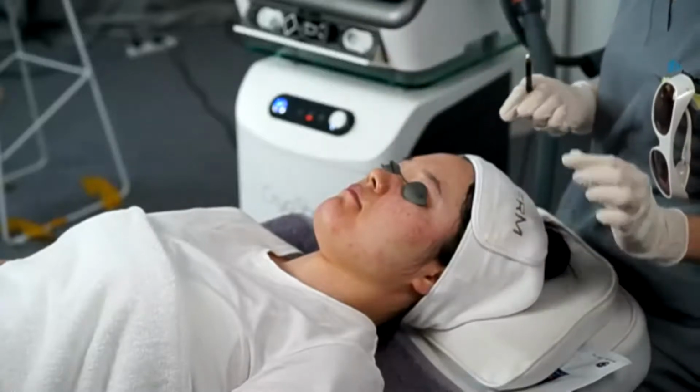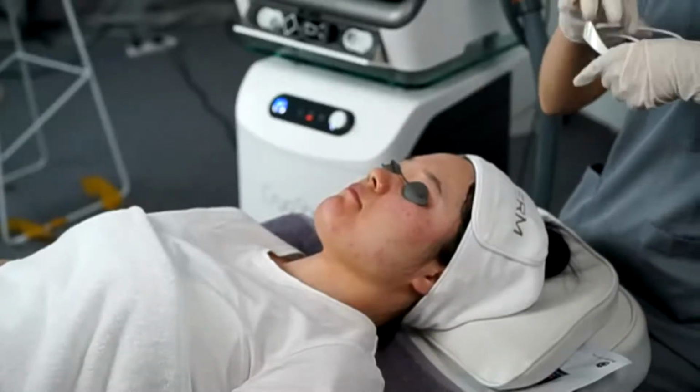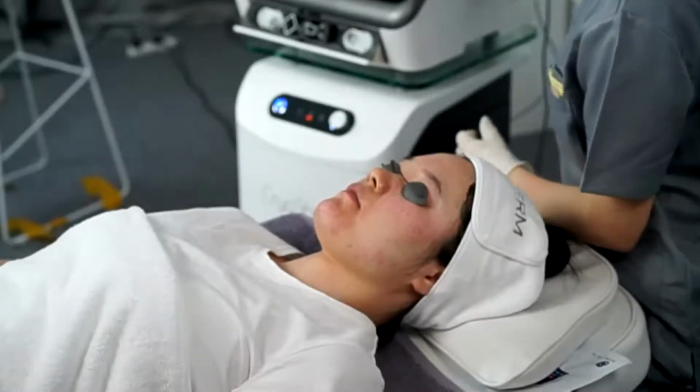According to our experience, this time for her treatment, we'll use the Accure applicator to do this serious part.